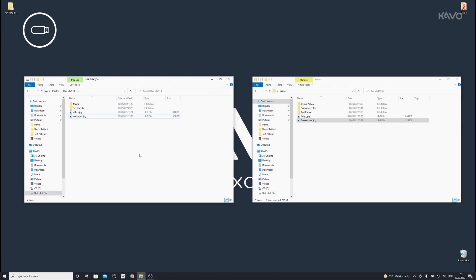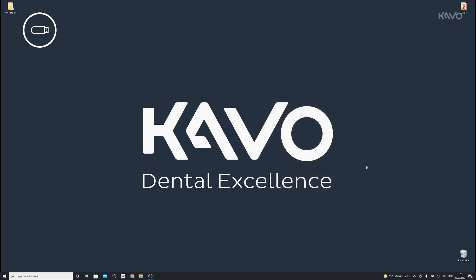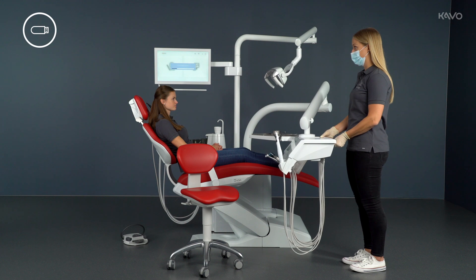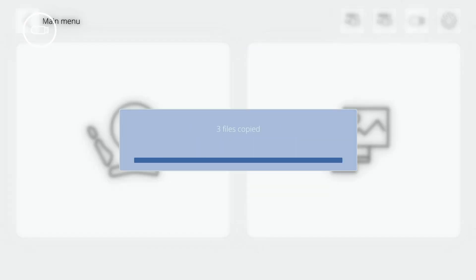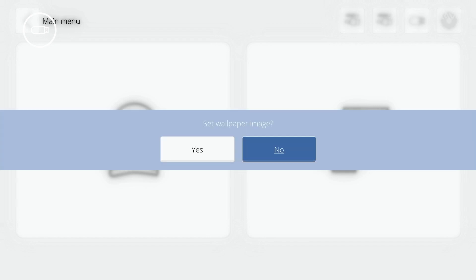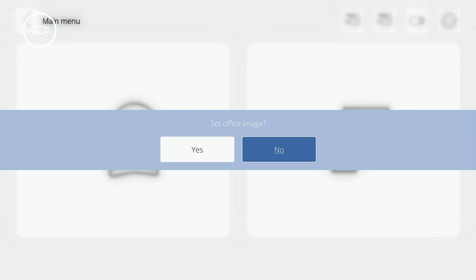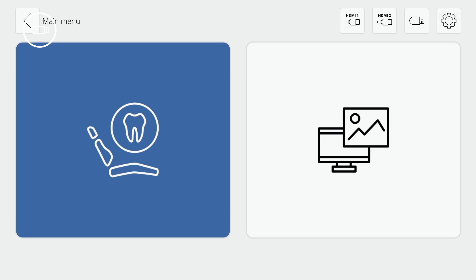Once you have copied all the data you want onto the USB stick, remove it from the computer and insert it into the dentist element on your treatment unit. Treatment data are automatically copied to the folder structure and media is automatically copied to the Media menu. If an Office logo is imported, the foot control must be used to confirm whether it should be set — the Office logo is then automatically displayed in the Welcome screen.